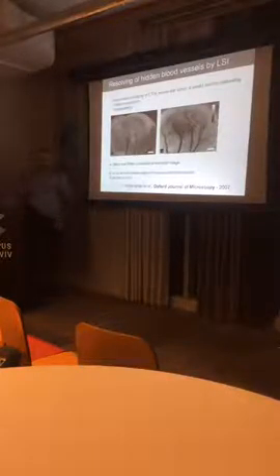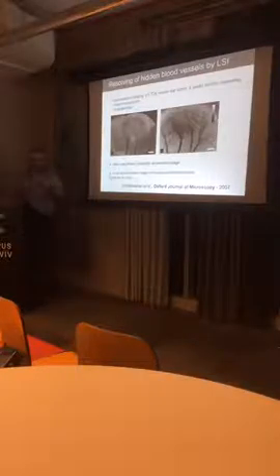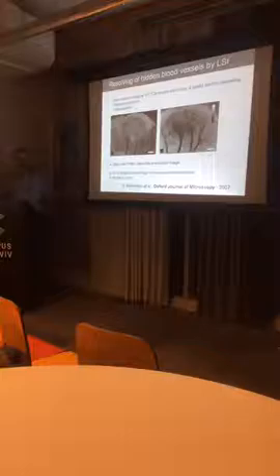I use a $10 laser, put a diffuser, and I can show at a workshop how it could be done, just taking the laser, making a diffuser, even from paper, illuminating an area, for example the mouse here, and getting the camera. More than that, I can use a little higher-intensity laser, illuminate my hand, and the laser speckle image that I get will correspond to the blood flow inside. It's like you use a Doppler. It's a laser Doppler imaging system, but it's absolutely simple.